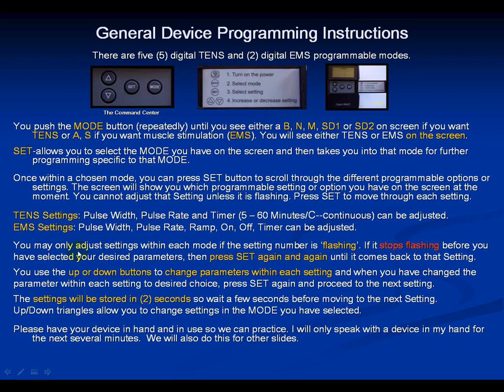Let's pick M for modulation. Push the mode button until you see M, then hit set to enter the modulation mode. Change the pulse width — as long as the number is flashing, turn it up to 150. If it stops flashing before you reach 150, push set again until you get back to pulse width, then set it to 150.